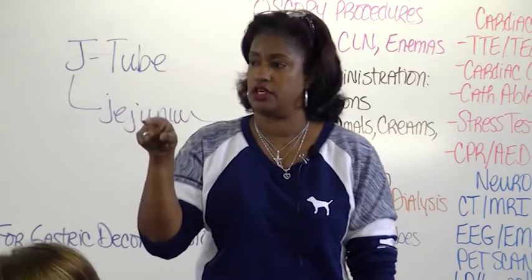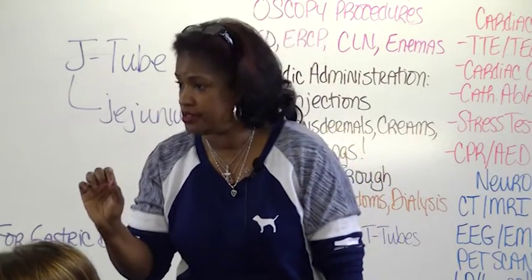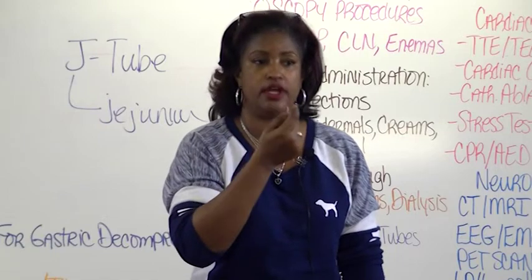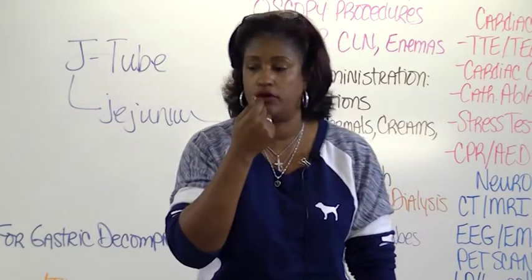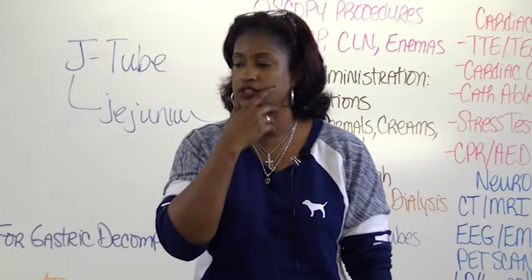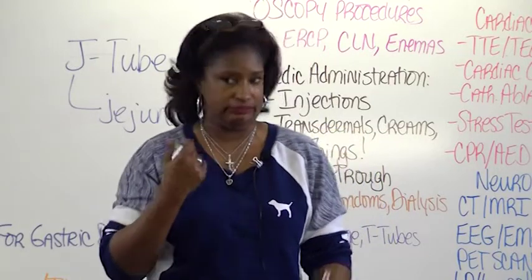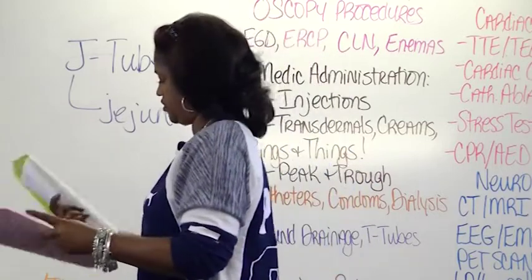Google image. What you have to put in your notes: TBIs get an oral gastric tube instead. Not nasal, oral. OG, we call it. OG tube. Okay, so that's that.